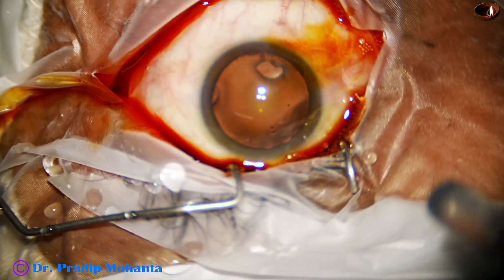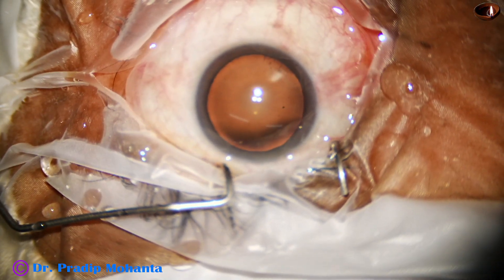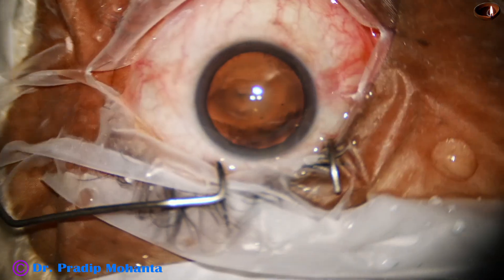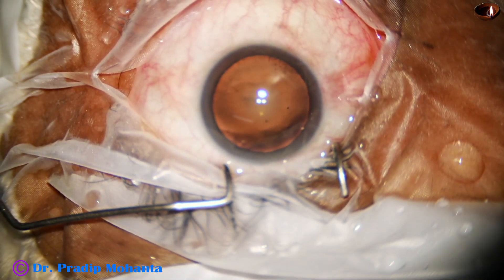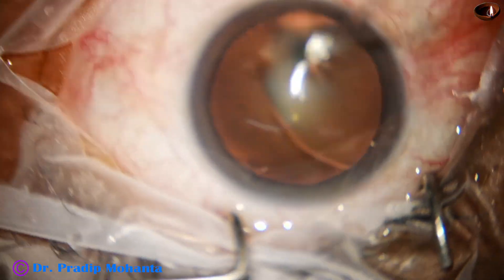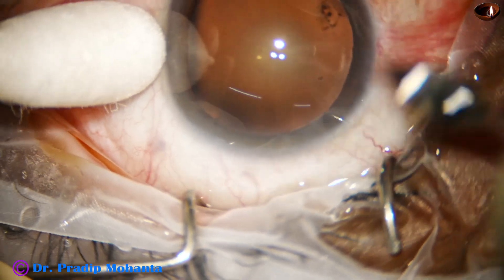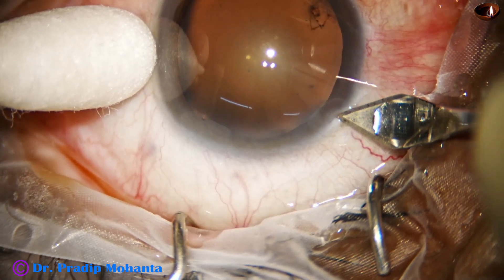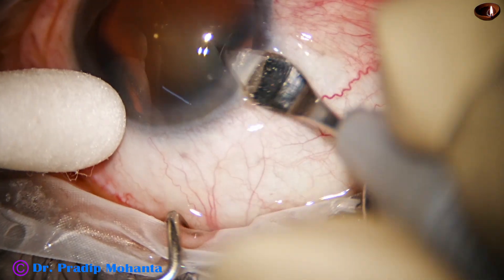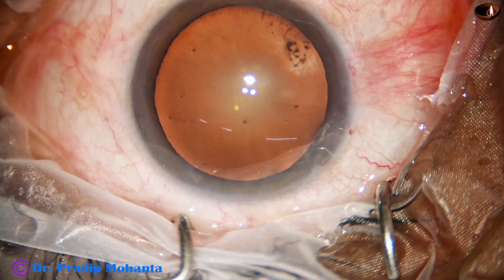The ocular surface is thoroughly irrigated with BSS or Ringer's lactate after applying a few drops of povidone iodine. The ocular surface was prepared in the preparation room — a few drops of povidone iodine was applied, the eyeball was kept closed for about five minutes, and then the ocular surface is washed with antibiotic drops. This is just a running wash on the operation table.